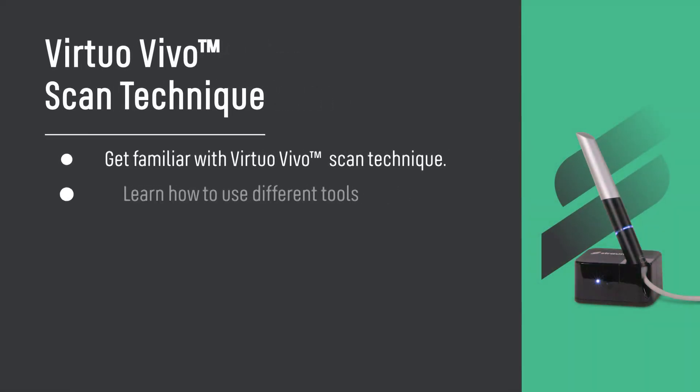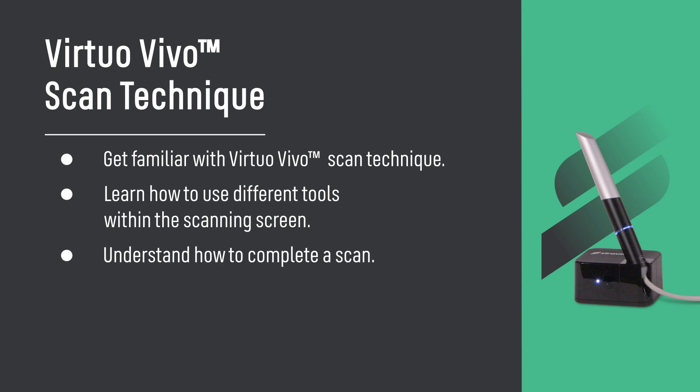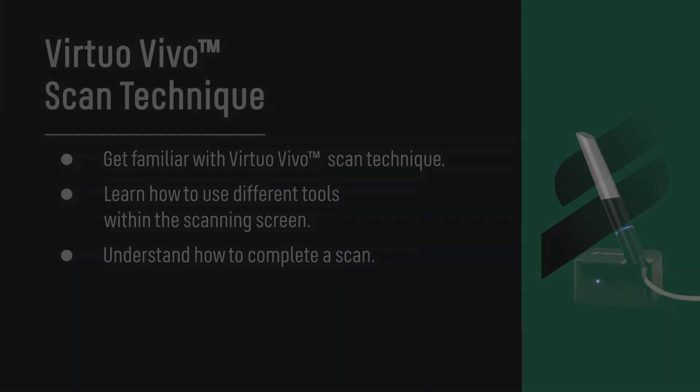Scan Technique. Get familiar with Virtuo Vivo scan technique. Learn how to use different tools within the scanning screen, and understand how to complete a scan.